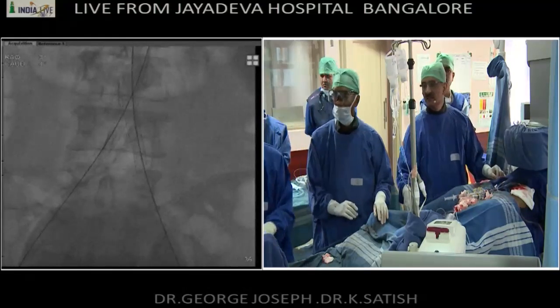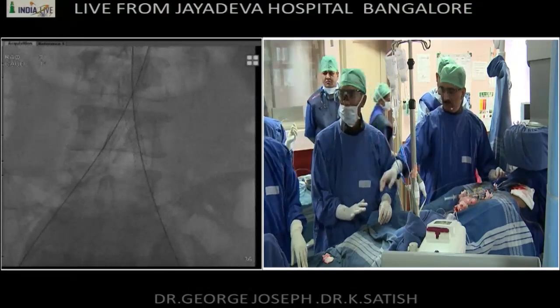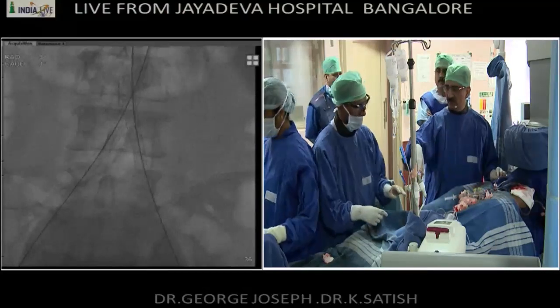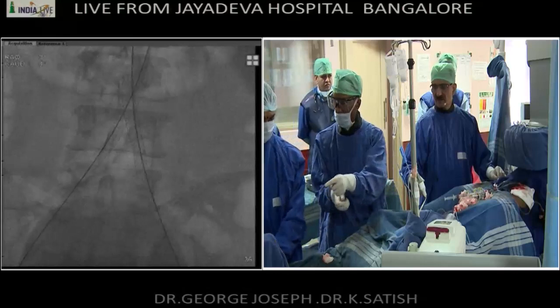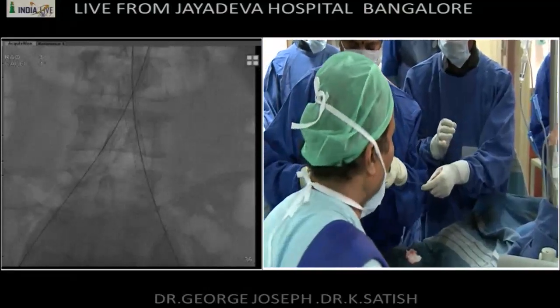Dr. Joseph, I think we hardly have 1 or 2 minutes. If you can show a final picture from the pigtail and then carry on, it will be okay. Okay, all right. Pigtail angio. We'll do the pigtail angio. They are going offline soon. And can we do a DSA picture? Any side. Yeah, that would be the best. Can we do a DSA?